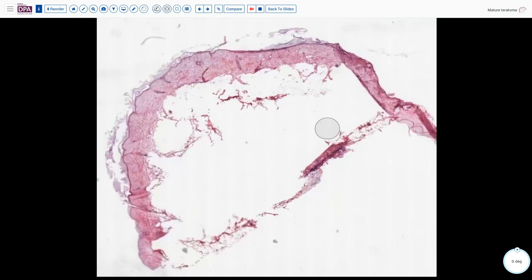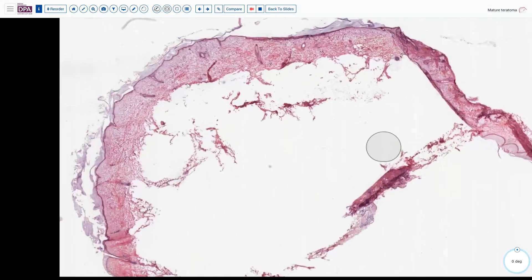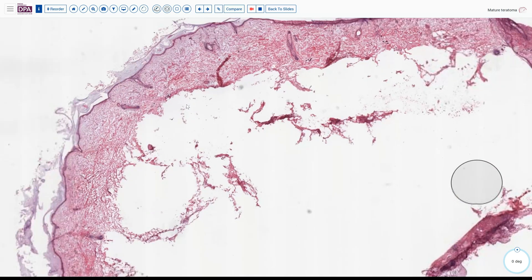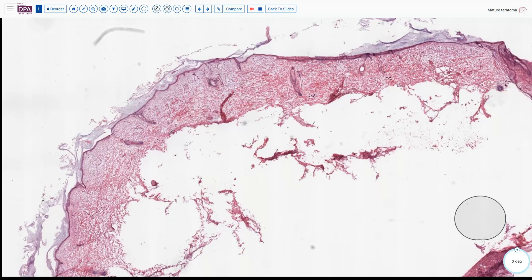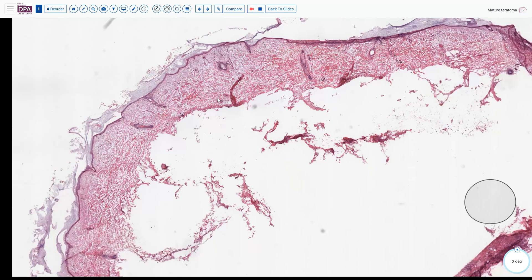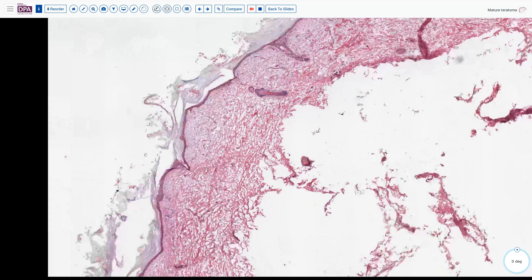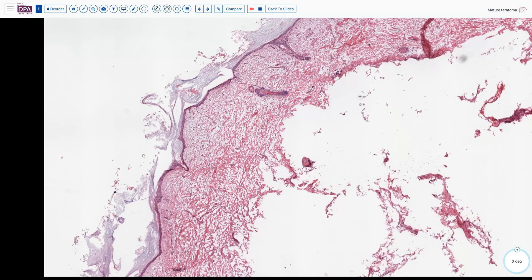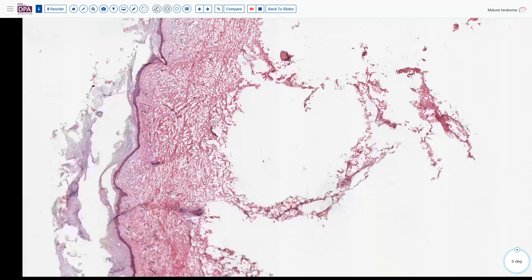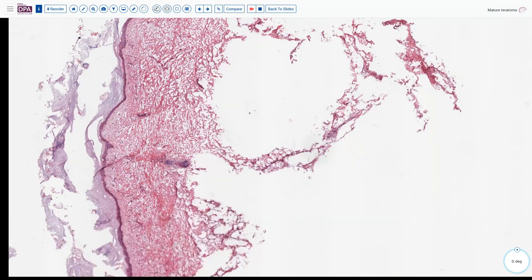Here's another of the frozen section materials, and you can see the way that the fat cuts poorly. Sometimes the artifact of wrinkling is difficult to overcome, and we also see the artifact of ice crystallization in some of these tissues. But the epidermal structures — keratin, hair follicles — manifest in the form of the fluid that was present in the mostly cystic space.